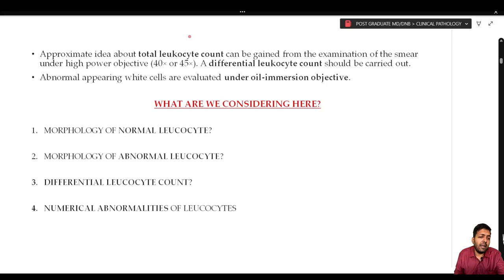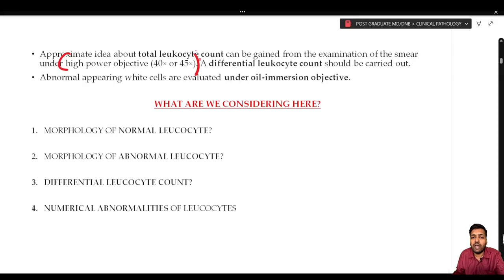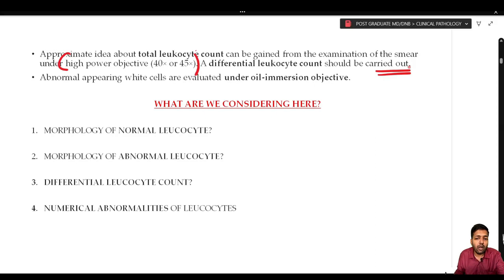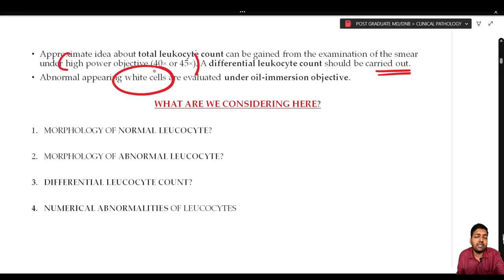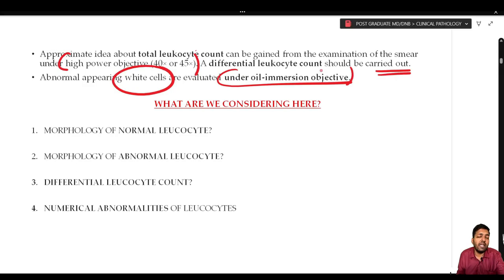As discussed in the previous lecture, an approximate idea about the total leukocyte count can be gained from examination of the smear under the high power objective. We take an average of four to five high power fields, count WBCs, and multiply by 1500 to 2000 to get a rough range. Differential leukocyte count should also be carried out, and any abnormal-appearing white cell seen under 40x should be evaluated under 100x oil immersion objective.